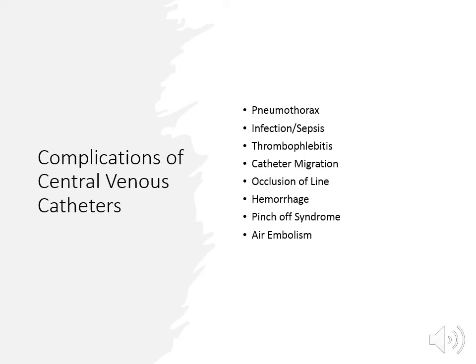You would treat an air embolism by positioning the patient on the left side, placing the head in the lowest position, Trendelenburg, so air will rise above the pulmonary artery. Make sure you notify the provider, and they may also be placed on oxygen.